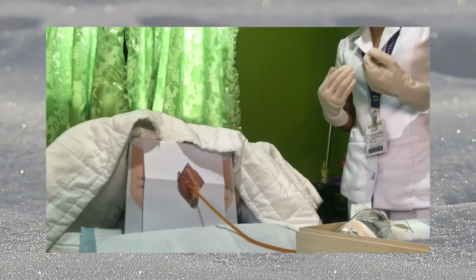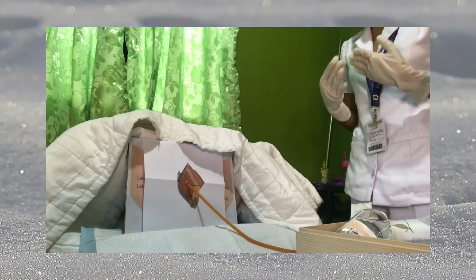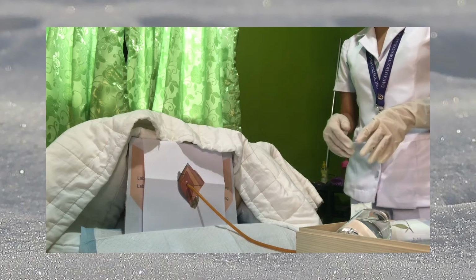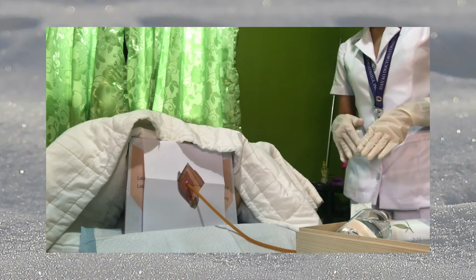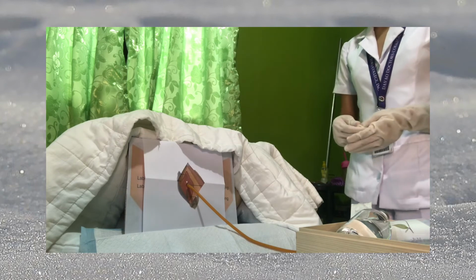Now let's do the aftercare. Afterwards, we need to place the patient comfortably and clean the equipment thoroughly immediately after use. Secretions, lubricants, and other substances are removed more easily when they are not coagulated.